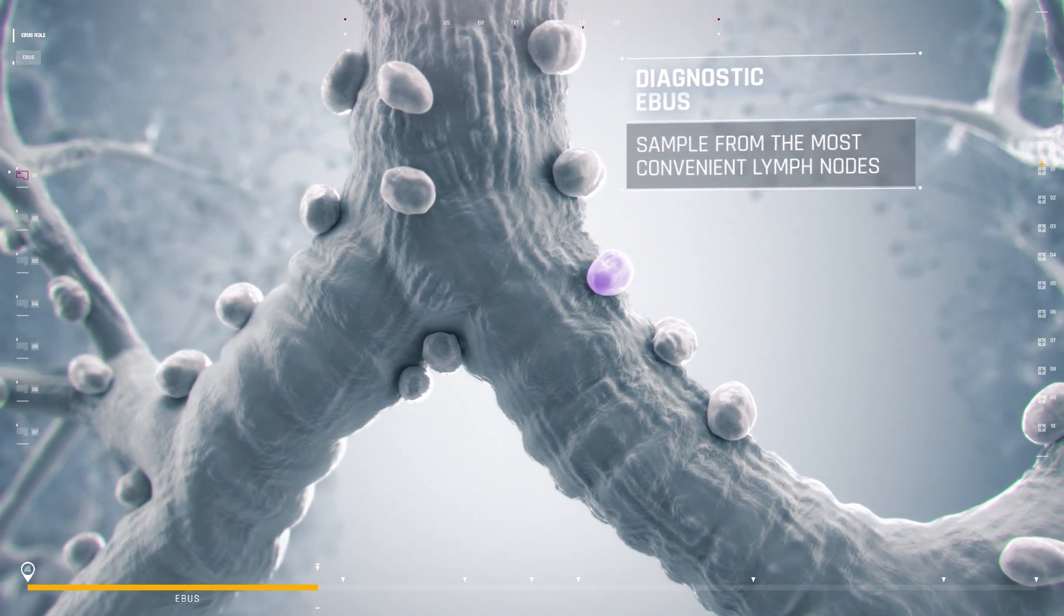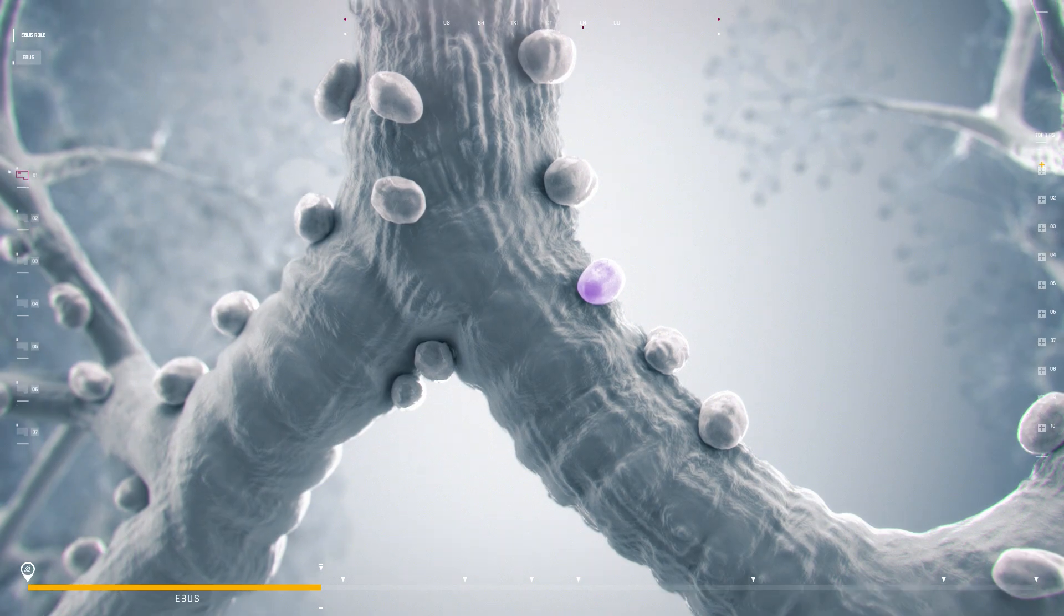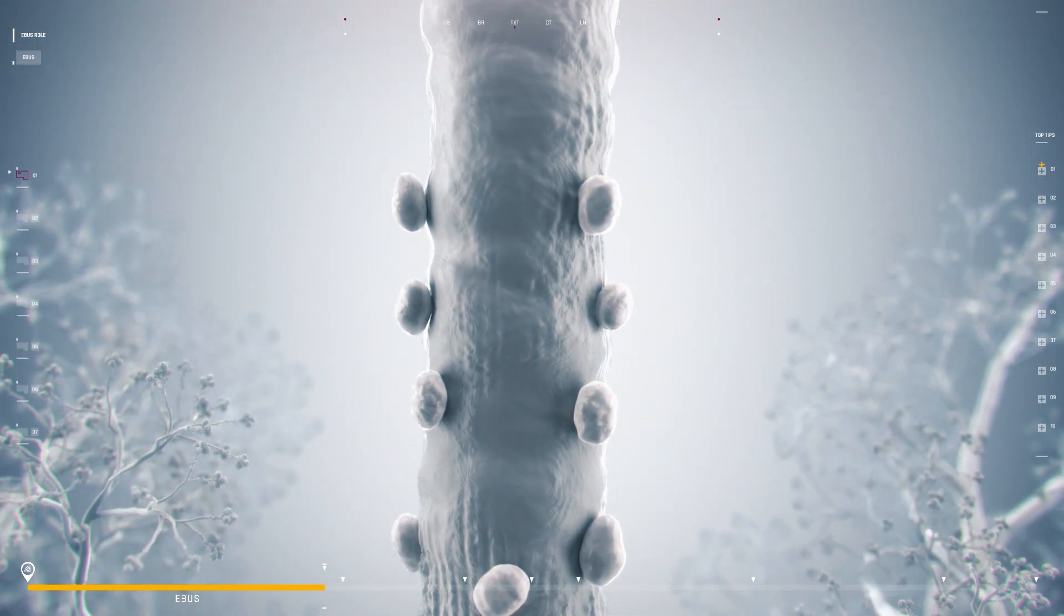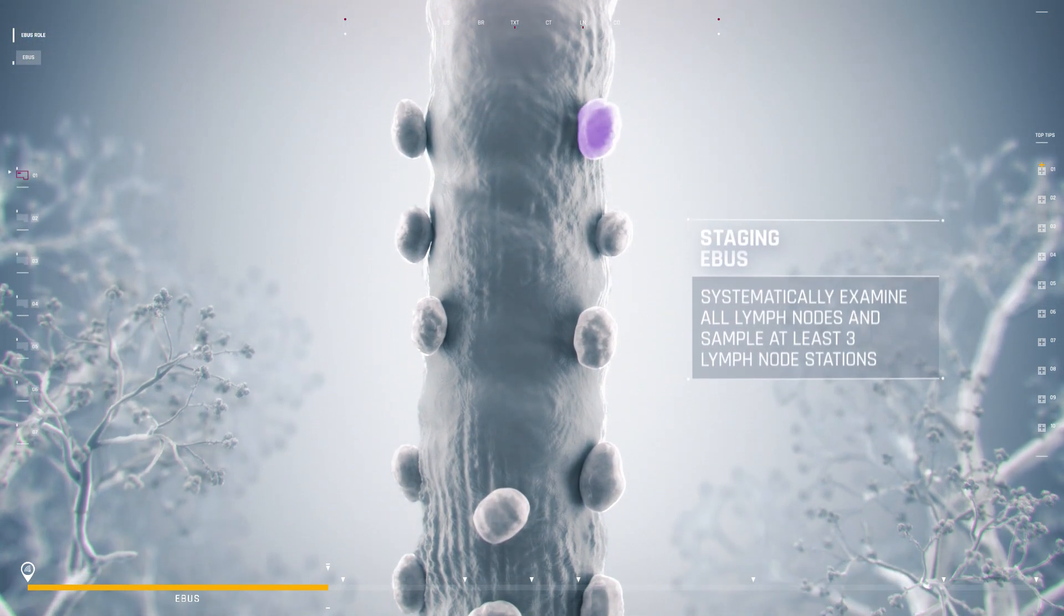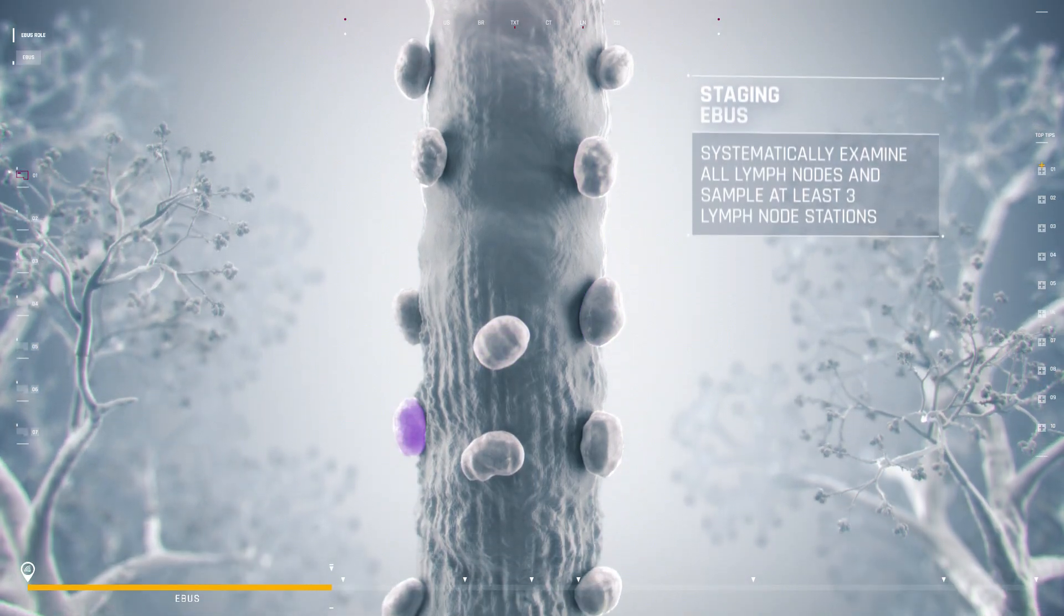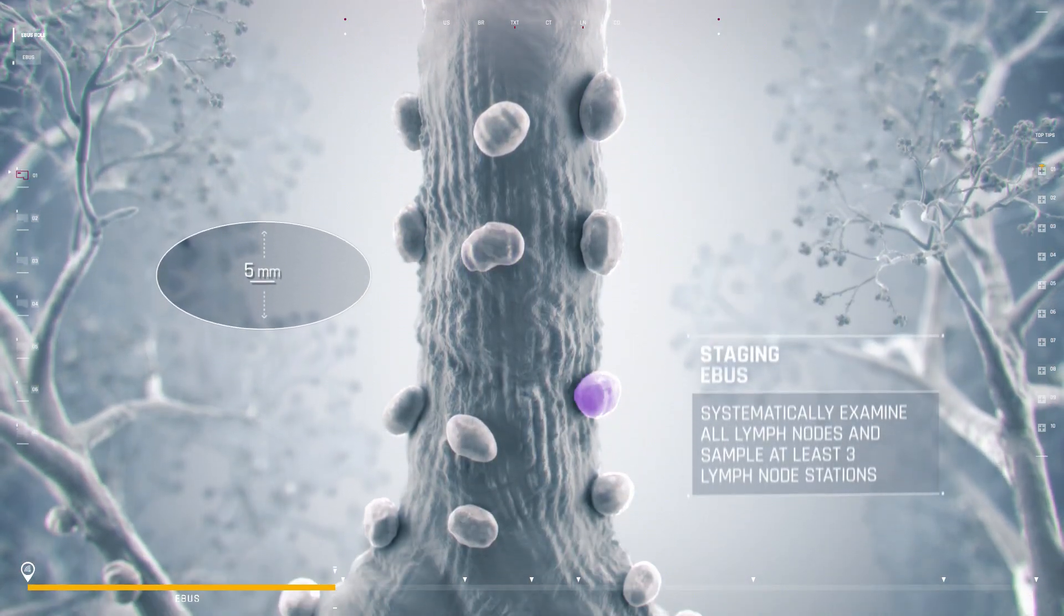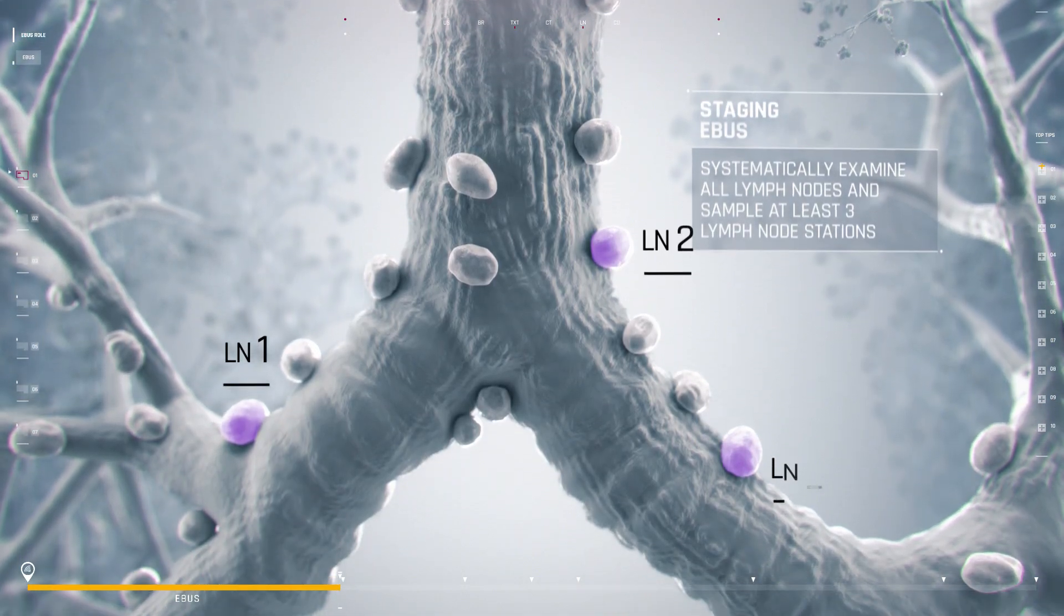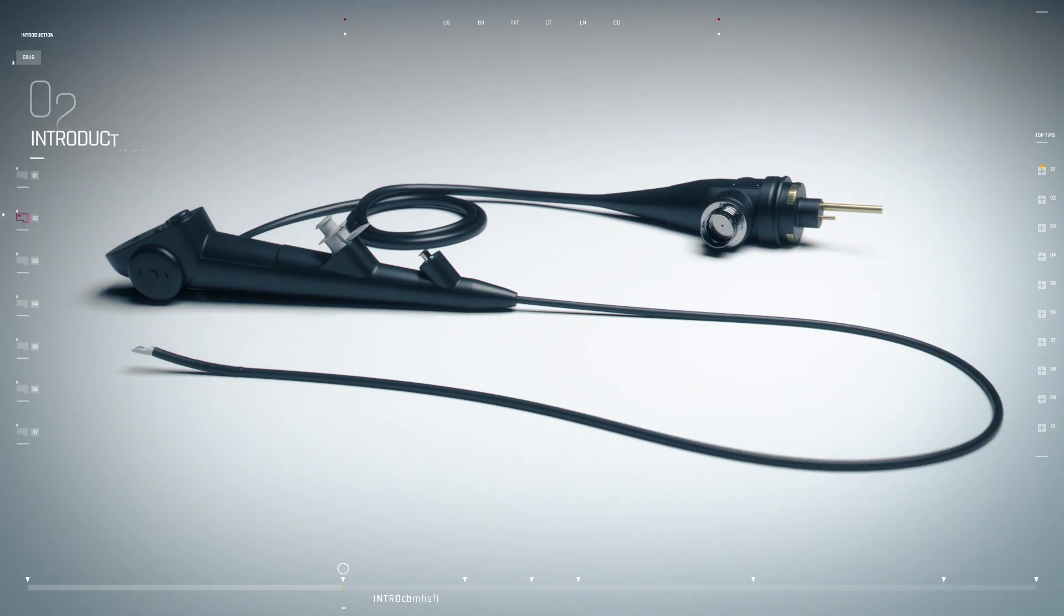For a staging EBUS procedure, lymph nodes are systematically examined by EBUS, and all nodes greater than five millimeters in short axis are sampled. There should be at least three lymph nodes sampled.